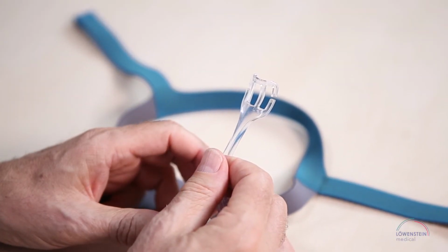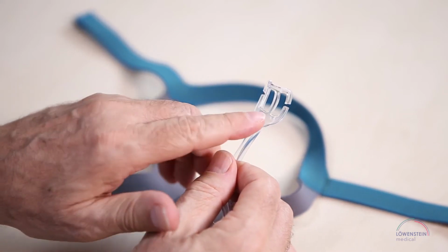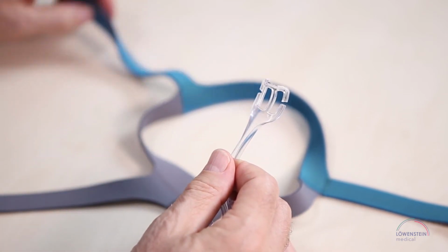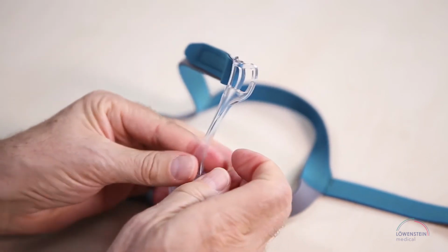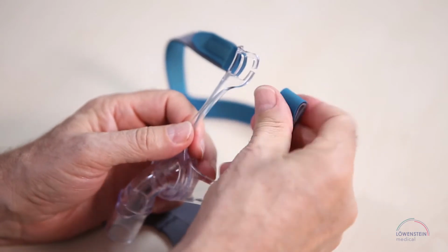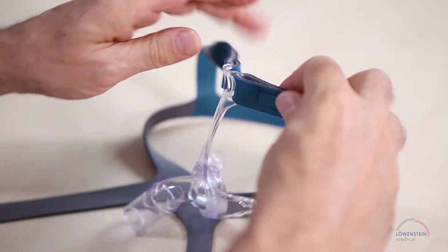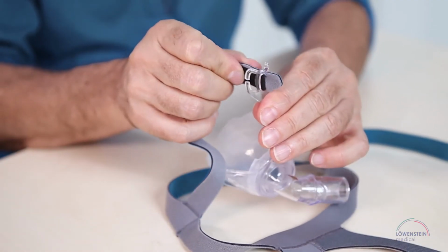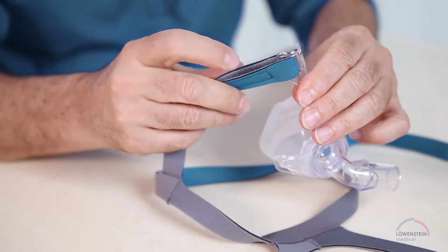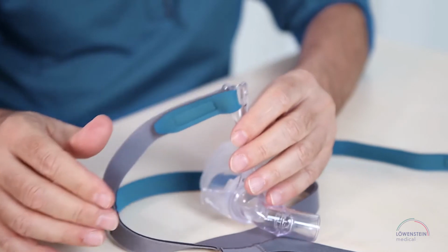On the upper portion of the mask, you'll see two different ways to fasten the headgear to the mask. We recommend that you push the headgear over the slits on the side without opening the hook and loop tabs. Then, your personal ideal setting will always be maintained. You may choose, however, to use the permanently assembled variant in the middle. To do so, loosen the tabs and thread them through the opening.